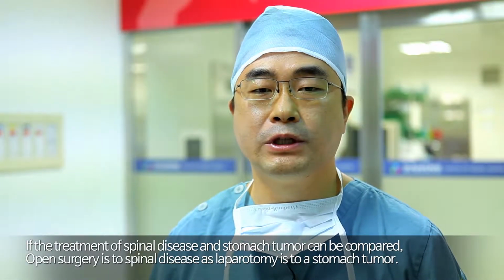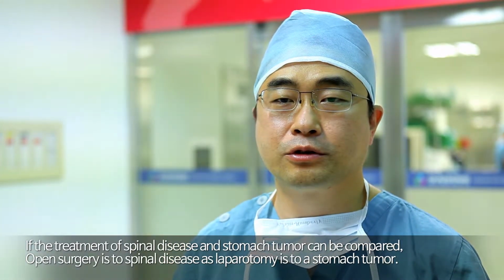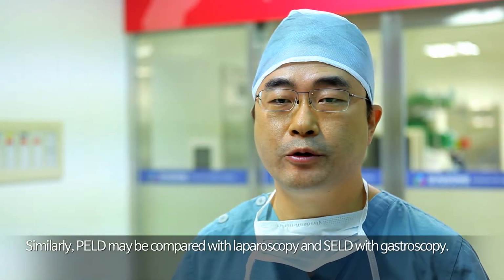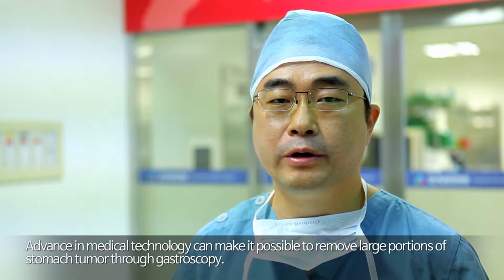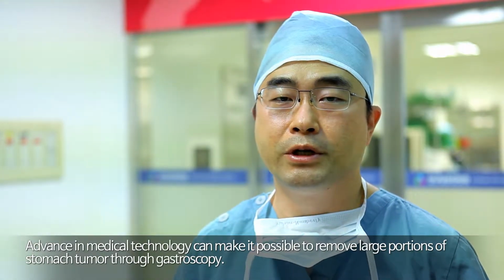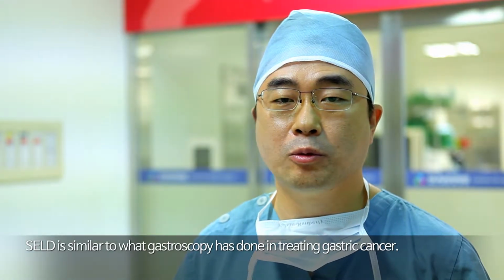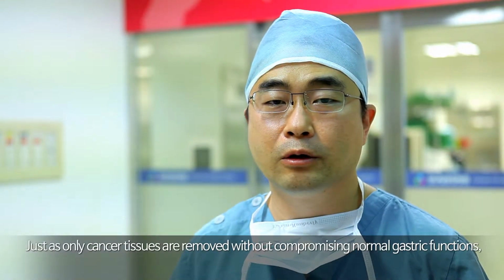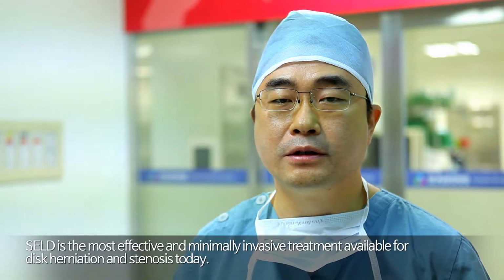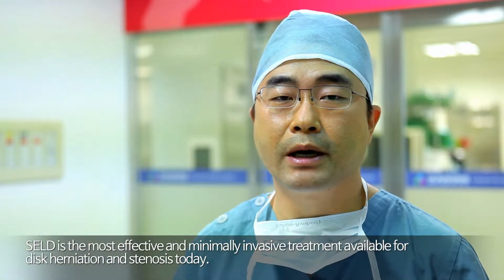If the treatment of spinal disease and stomach tumor can be compared, open surgery is to spinal disease as laparotomy is to a stomach tumor. Similarly, PELD may be compared with laparoscopy and SELD with gastroscopy. Advances in medical technology make it possible to remove large portions of stomach tumor through gastroscopy. SELD is similar to what gastroscopy has done in treating gastric cancer. Just as only cancer tissues are removed without compromising normal gastric functions, SELD is the most effective and minimally invasive treatment available for disc herniation and stenosis today.